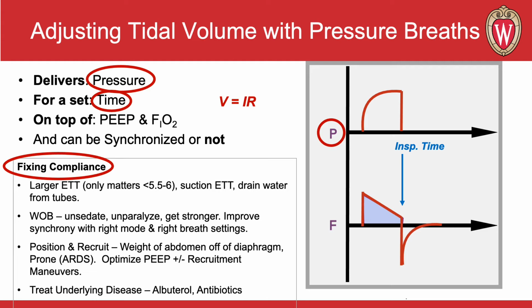You can also adjust the inspiratory time, knowing that if your inspiratory time cuts the breath off here, you've missed out on a lot of tidal volume. And an increased inspiratory time will help you a lot. In the picture I've shown, increasing the inspiratory time would only gain you this tiny little pyramid over here. Not much tidal volume there. And so inspiratory time adjustments are a finite resource.